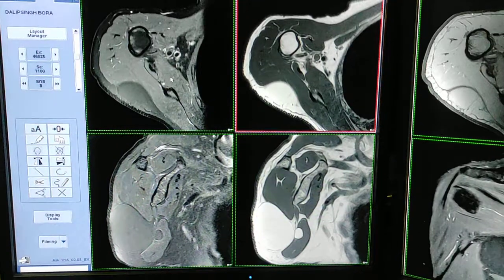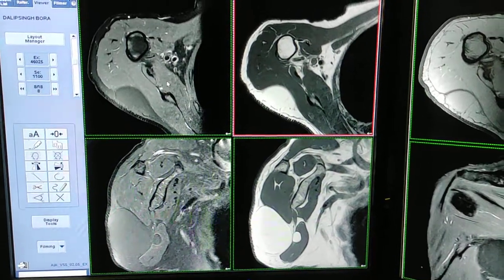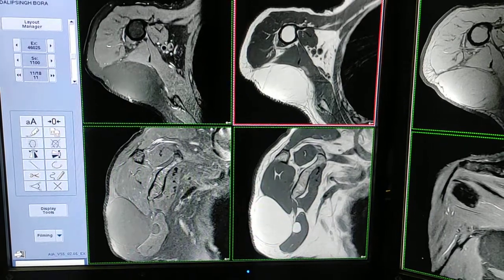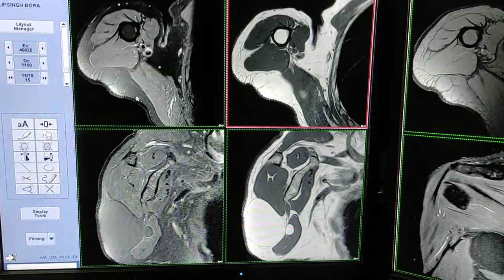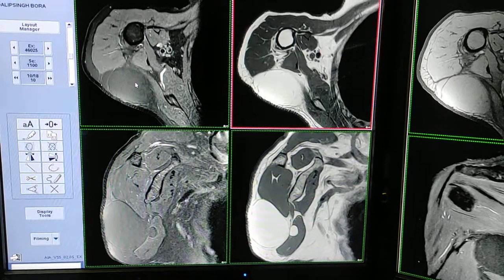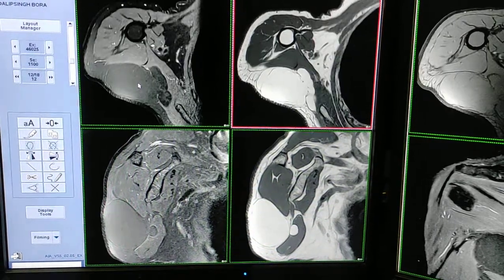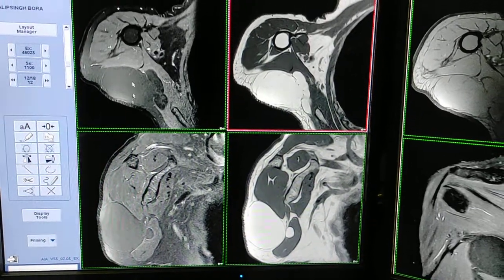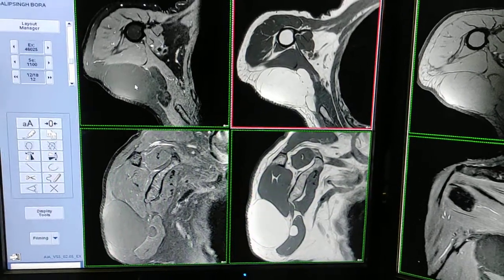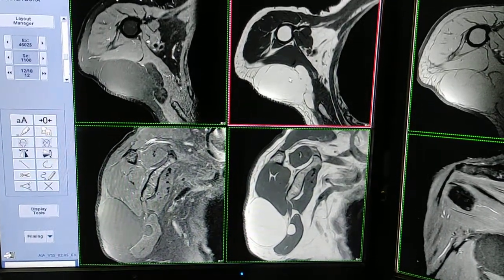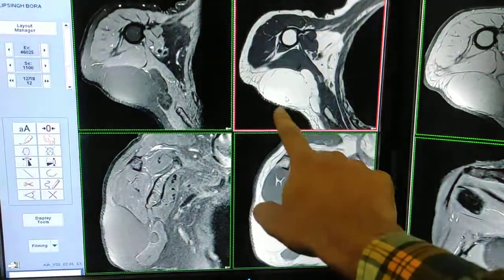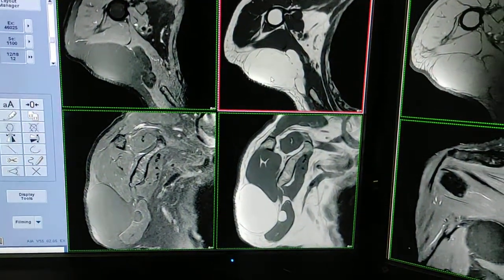This is four sequences — axial fat-sat PD. This is the lesion, a large lobulated lesion. Posteriorly you can see the lesion is iso-intense on fat suppression, as seen on this fat-sat PD image. This is the lesion; it is hyperintense on the T1 sequence.